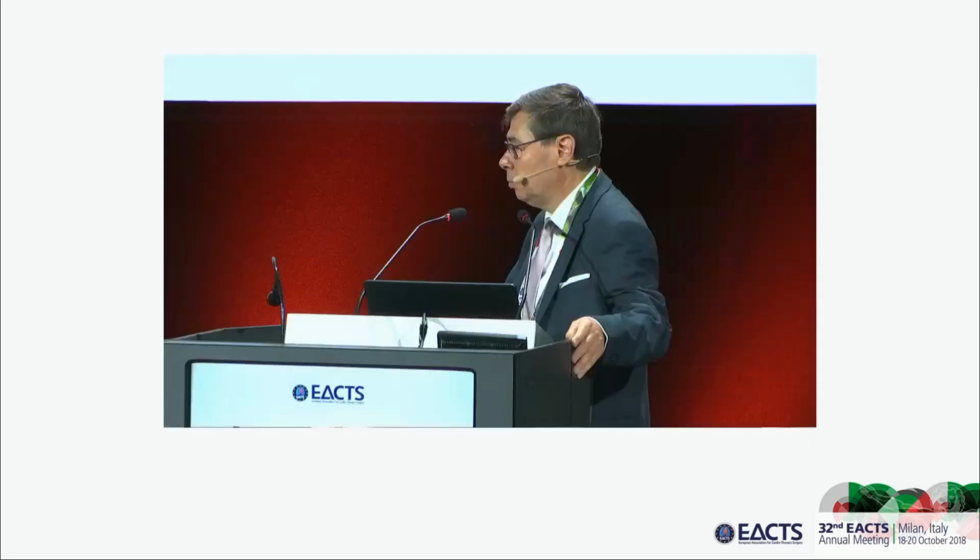This is typical for bicuspid, actually, because they always look lower as compared to the tricuspid. Exactly. I would say that maybe for tricuspid, you should try to achieve a good effective height of all three cusps. But this is important, because even in the complete absence of regurgitation post-op.